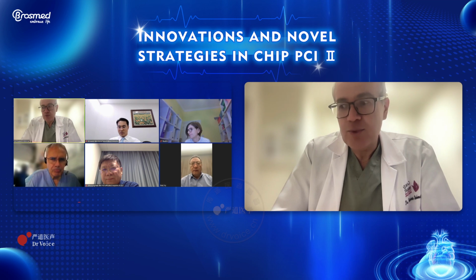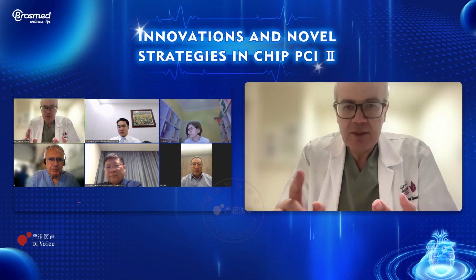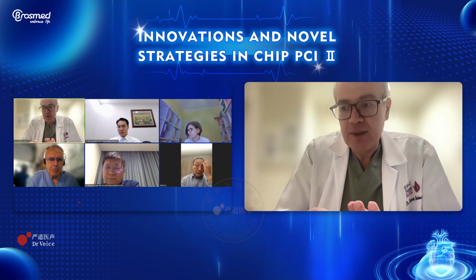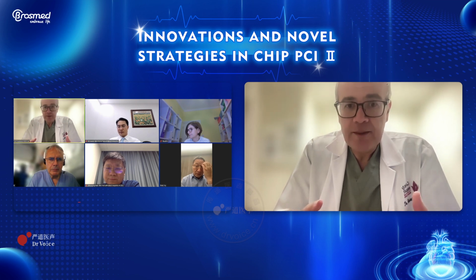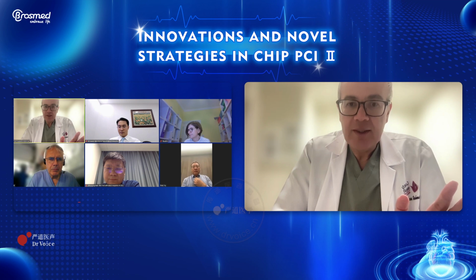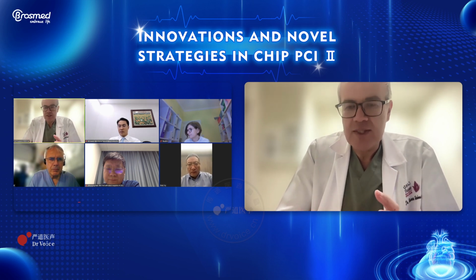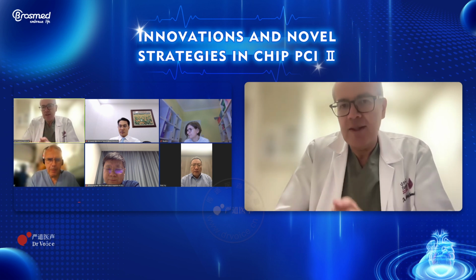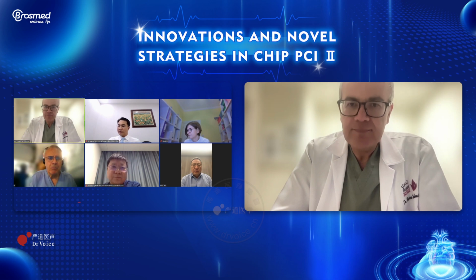So if we manage to minimize the thrombus burden with thrombus aspiration, with a good antiplatelet, or even if the thrombus is a benign one that responds nicely to a semi-compliant balloon, then I would proceed for a drug-coated balloon strategy. But if the thrombus worries me and there's a significant distal embolization, and I'm worried that the more I manipulate the lesion, then I run into trouble, then I throw in the stent directly. Okay.